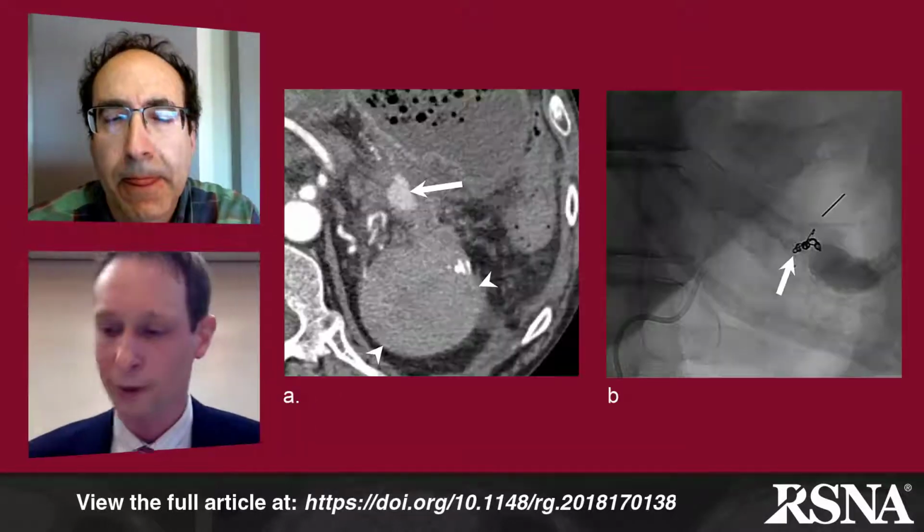That's great. Thank you. So moving on to the focus of your paper, let's talk a little bit about computed tomography, which I think, as you've stated, provides significant advantages in the evaluation of these patients. You've discussed the role of CT in the assessment of GI bleeding, and in particular, the two methods that you describe in the paper are CT angiography and multi-phase CT enterography. We'll look at figure 1, which I think illustrates the use of CT angiography for the evaluation of a patient with recurrent GI bleeding. So let's take a look at that figure now. Okay, so we'll pull that figure up.